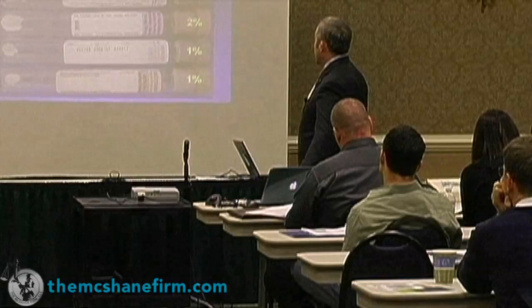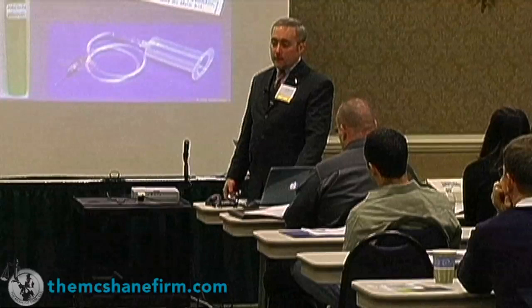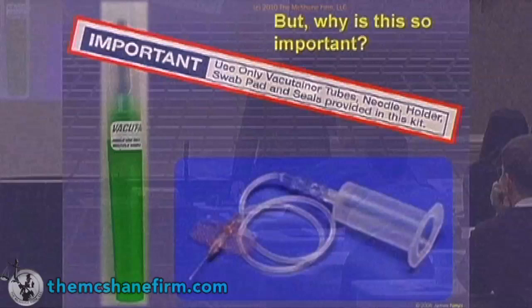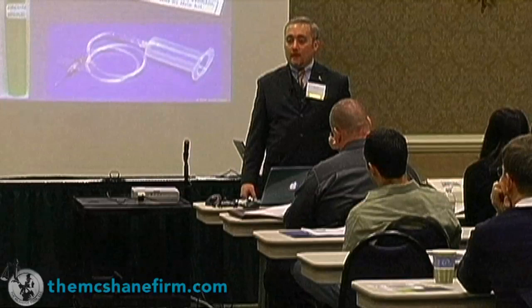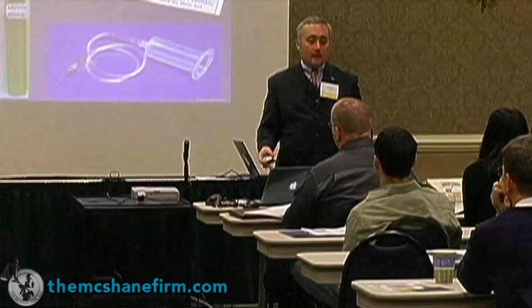As an aside, very quickly, the different colors of the needles have to do with the gauges of the needles. There's no consistency between manufacturers. And the reason why it's important is for this little device right here. It's called the butterfly needle. A butterfly needle is used for two particular reasons. Number one, they say for comfort, because there are people who have needle phobias. A smaller gauge needle, which is exactly what a butterfly needle is, when you put it in the person's arm, is supposed to be not such a traumatic event for them, as opposed to a wide bore needle, which is what we saw up there.